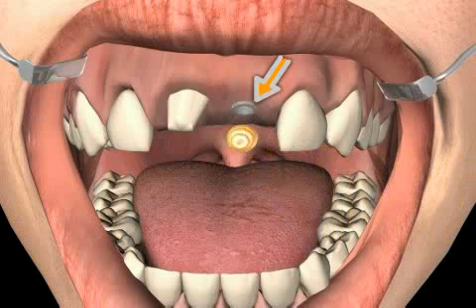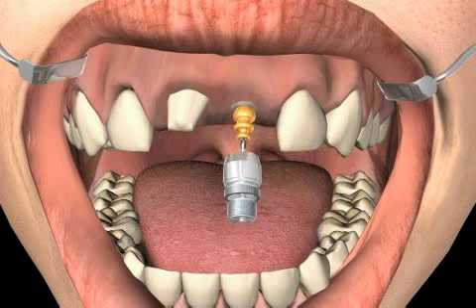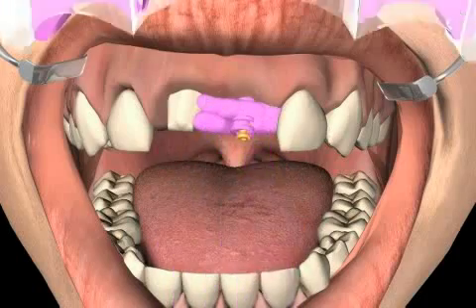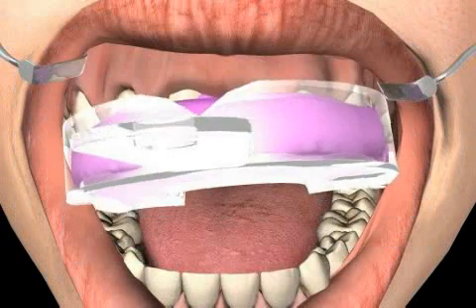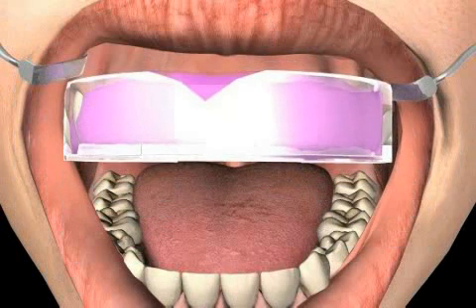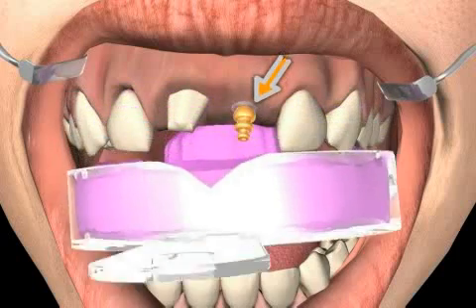You can see the implant on the bone, where the impression rod used for the reposition technique is now screwed onto. The impression spoon is inserted into the mouth with the impression material. The impression is removed after the material has hardened. However, the impression rod remains on the implant and in the mouth for the time being.